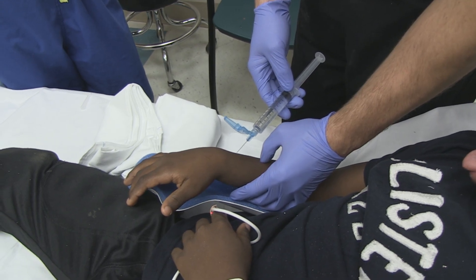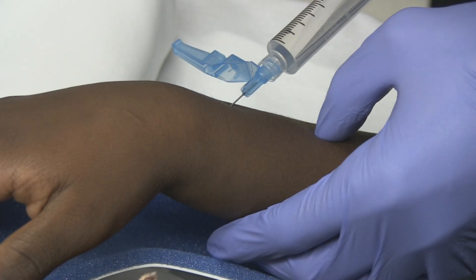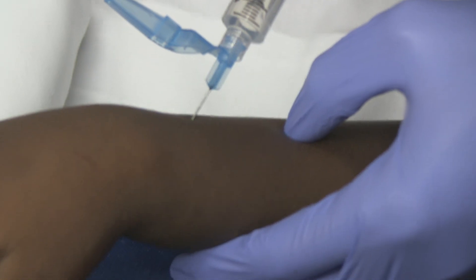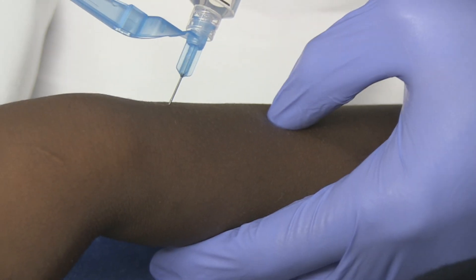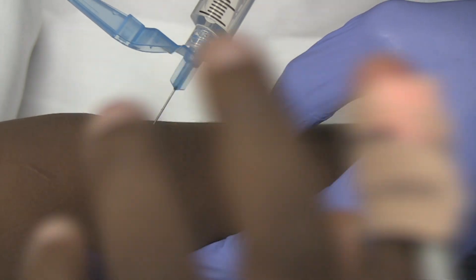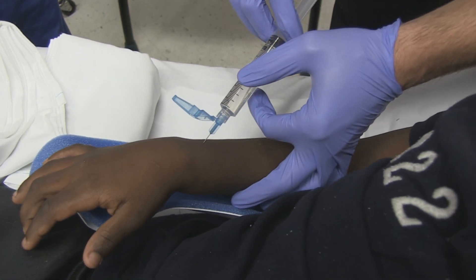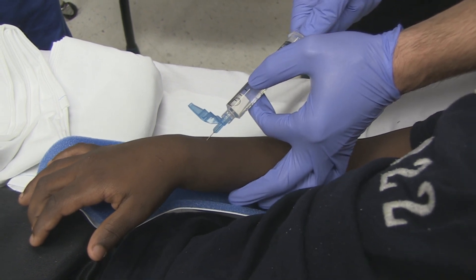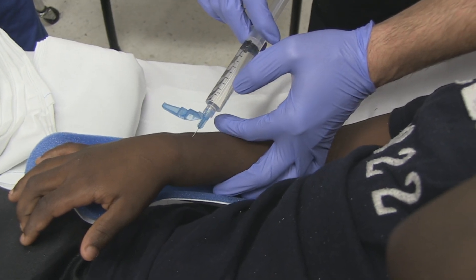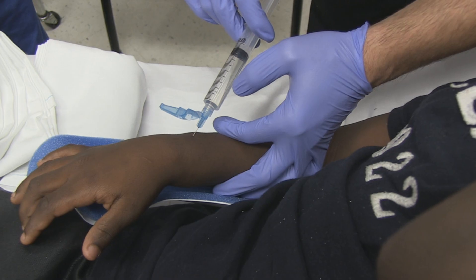Just angle it. Sometimes you can feel like you're hitting bone. You're doing great, buddy. You may or may not get flashback, but — there, I think that's it. Should go in pretty easily. And if you just bathe it around there, it works just fine.